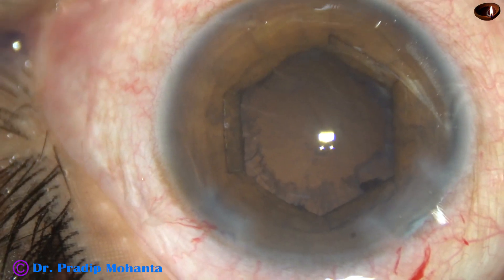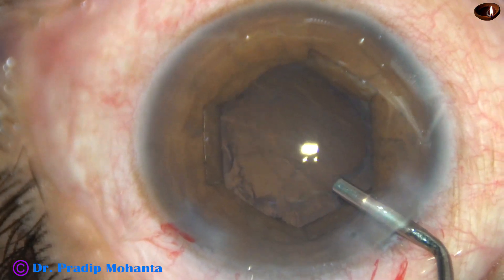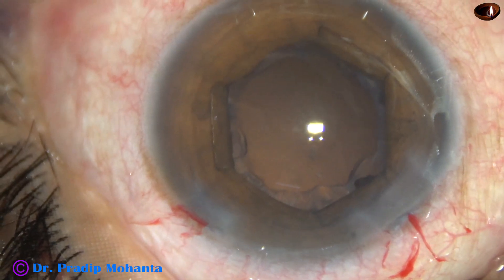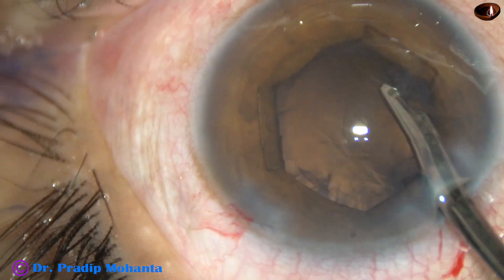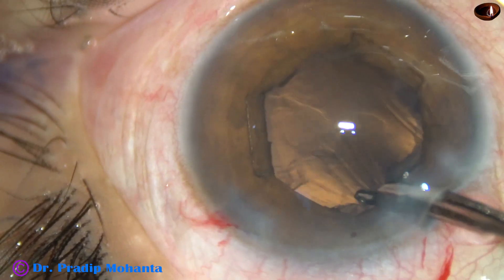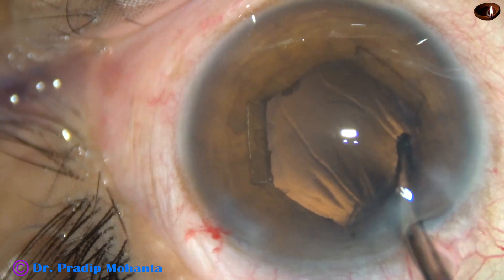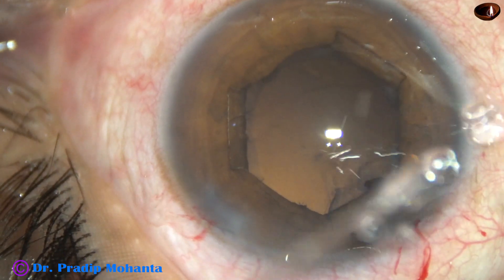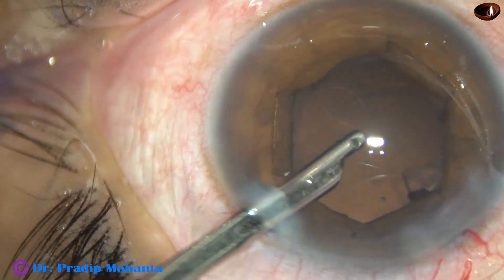Visco is injected — 2% hydroxypropyl methylcellulose is injected to fill up the anterior chamber. Since I have only one side port, I am going to use the Simcoe cannula; we can use coaxial irrigation-aspiration also. The size of this side port is about 1.6 mm. If we make two side ports of 1 mm each, that is about 2 mm and 2 incisions. One side port 3 o'clock hours away will reduce the astigmatism induced by the main incision.